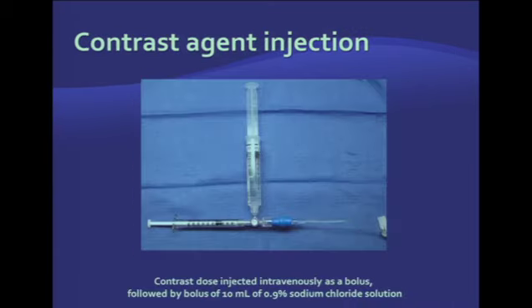There are different ways of injecting ultrasound contrast agents, but most labs will use some kind of three-way stopcock or dual lumen line. All of them will require a 10 to 20 cc saline flush to clear the line and push microbubbles into the circulation. We like to connect the contrast syringe to the straight arm of the three-way stopcock to prevent turbulence and save microbubbles from bursting. Your flush syringe can go to the side arm and be used to flush microbubbles through the line.